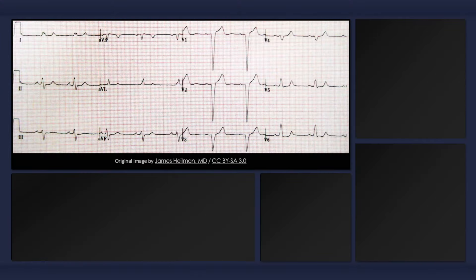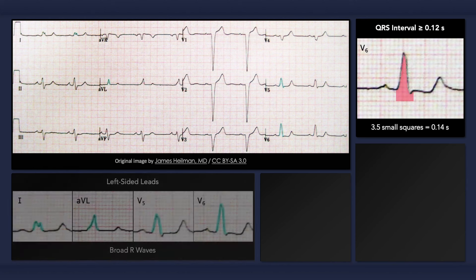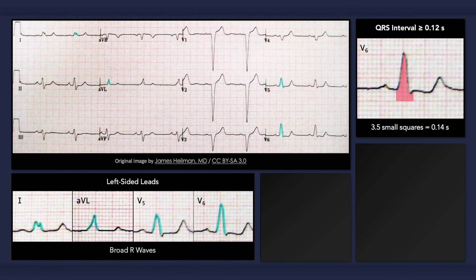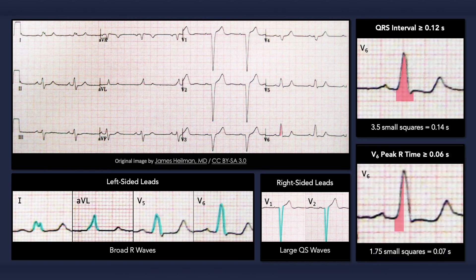To quickly recap, the main ECG findings that can occur with left bundle branch block include QRS prolongation, broad R waves in left-sided leads, large QS or RS waves in right-sided leads, and a prolonged peak R time in leads V5 and V6. And remember to always keep in mind that a left bundle branch block can mimic, conceal, or be caused by myocardial ischemia or infarction.